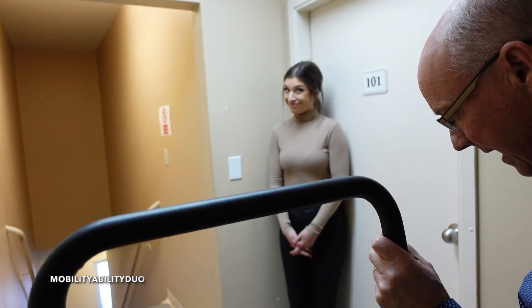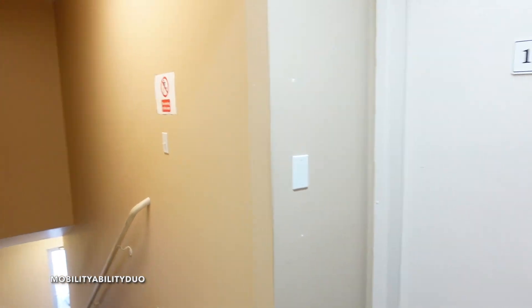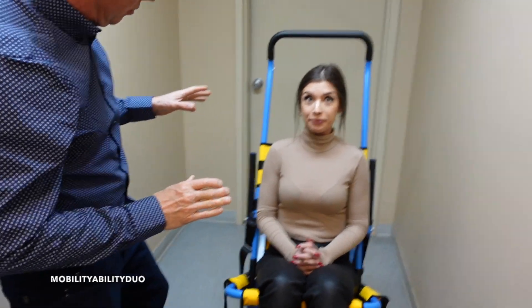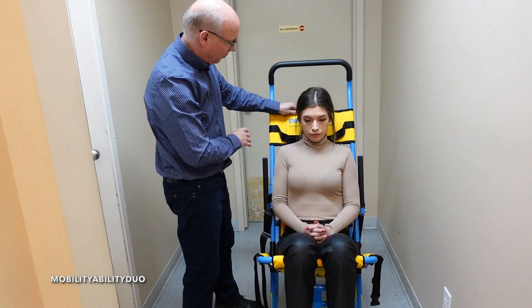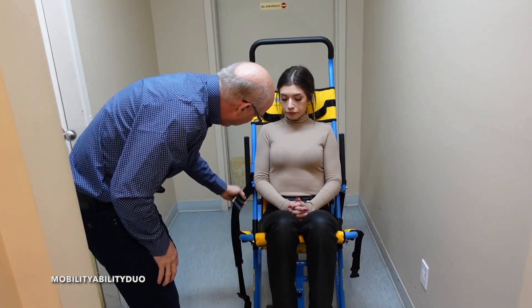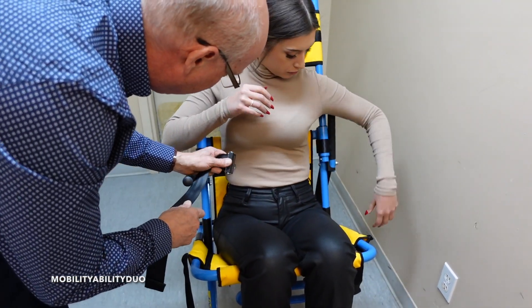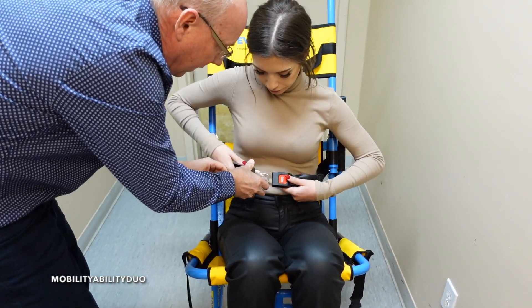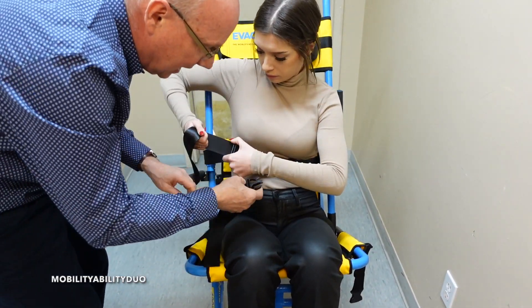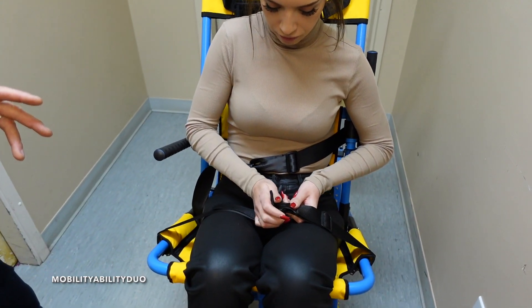So our volunteer Kim is going to grab the seat and get in here. There are a couple of features I really like. One of them is this headrest - we can move it according to the height of the client. Kim says that feels really comfortable. We're going to put the belts on. There are armrests here that make it really comfortable, and you can put a seatbelt here. There's also a nether belt. You've got a couple of belts just to make people feel comfortable - those are all the safety features.